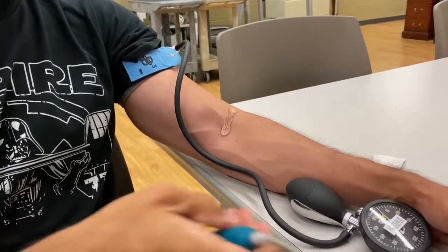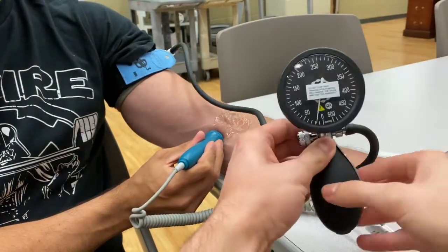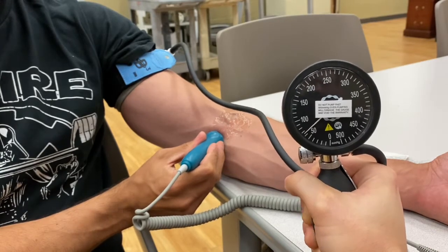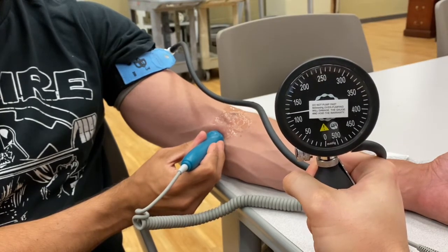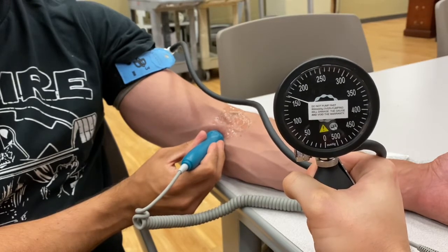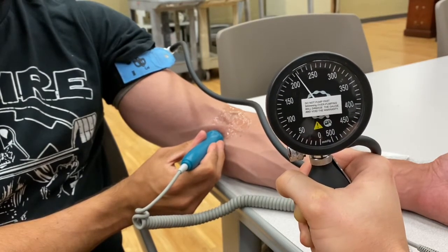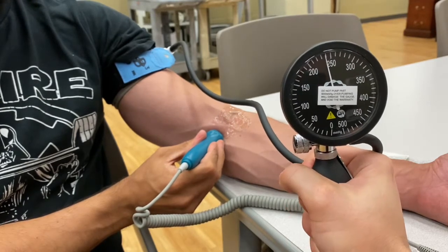So turning the ultrasound on. So we found the brachial artery. We're going to go ahead and very slowly pump it up to the point where we can no longer hear the sounds coming from the ultrasound Doppler. We're going to go up by about 10 to 20 millimeters of mercury at a time. That way we can determine that point and not have to pull back. So we're going to keep going up until we can no longer hear it. Good, the sounds are petering out. A little bit more.